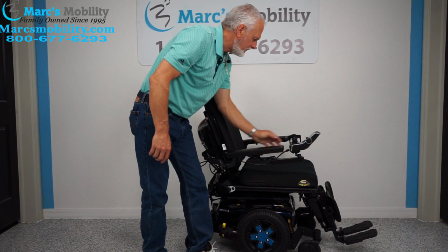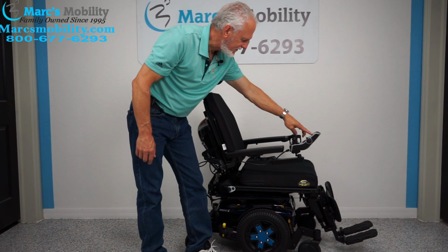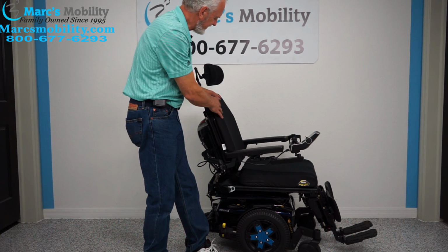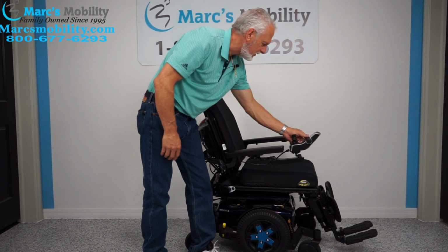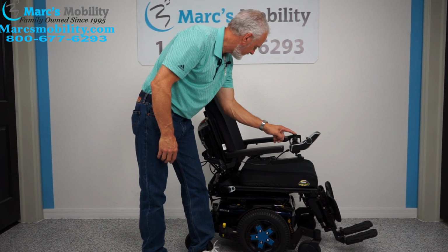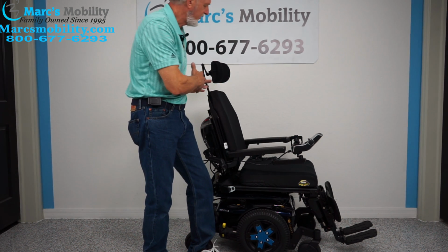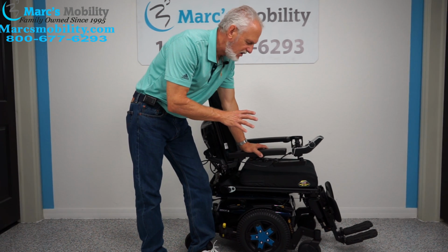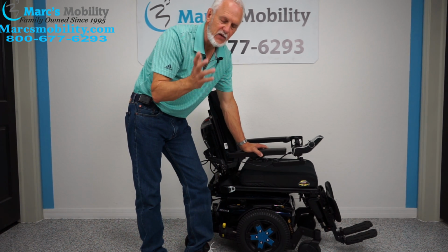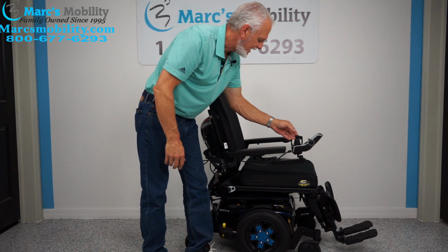Right now there's a red X on my screen. The chair will not drive when there's a red X. That's because the seat is still too far back. So I've got to put it back. It's probably not far from coming back though. There we go. It just turned green. So the seat was too far back. This chair knows it's not going to let you drive with the seat way back there because it's unsafe. Okay. So now I'm going to put it back in drive and the chair will move.